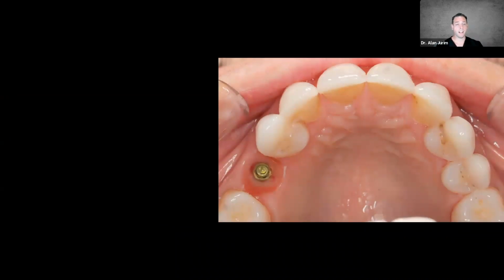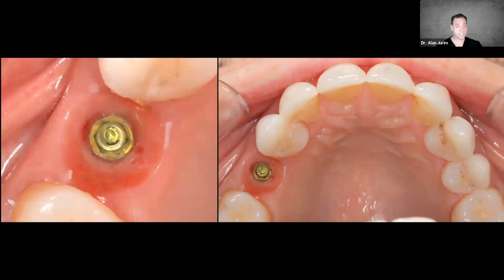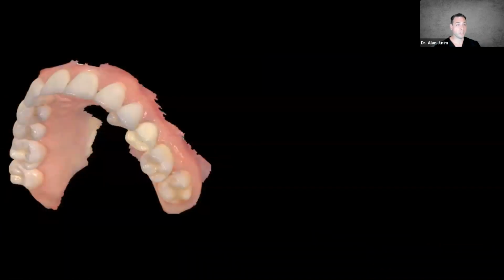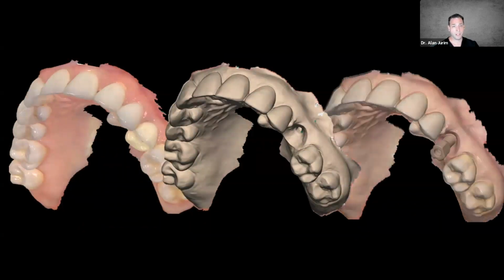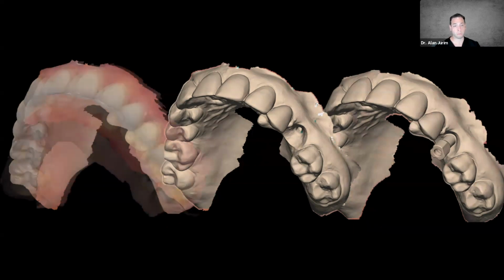Once the implant's been placed, and a lot of times we do produce immediate provisionals depending on the case selection, this is what it looks like 4 months later when we first remove the provisional crown and we're ready to do the final restoration. Implant's in the ideal position. We have great tissue contours, and it really translates to when we're ready to do the final restoration that we have the most predictable outcome and with the least amount of hurdles. So we formed the tissue, we already have the optimal placement of the screw access hole, we've optimized the size of the implant, and we also made sure it's the safest process possible.